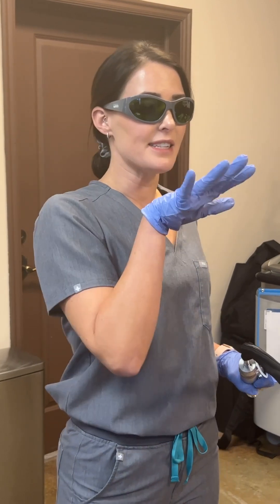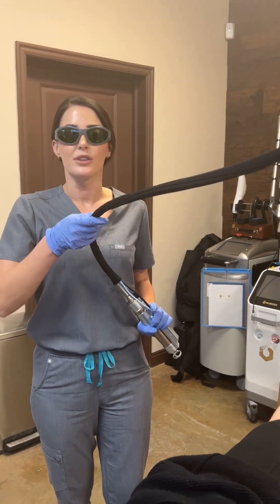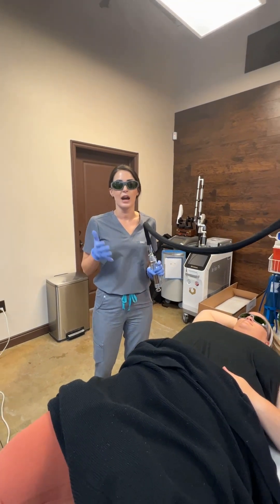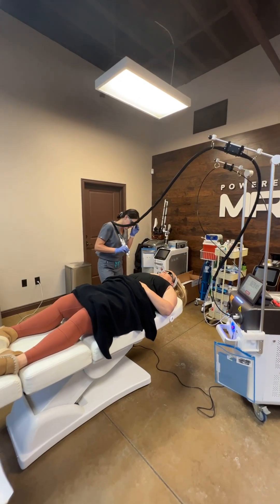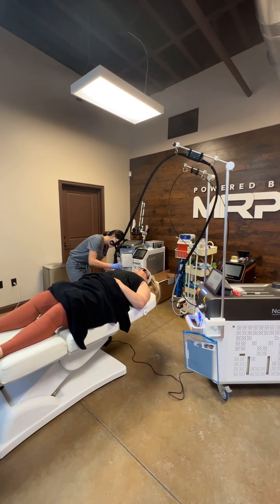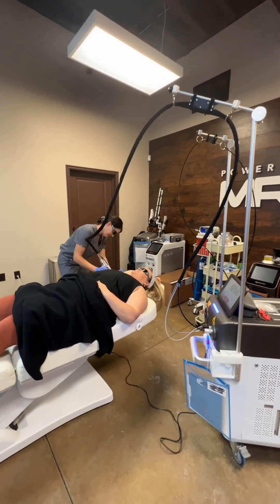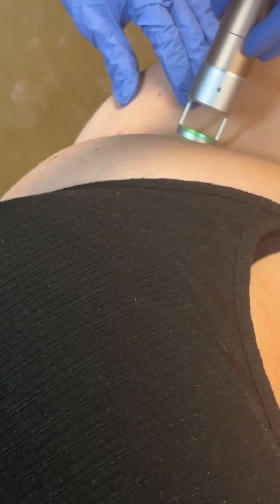That doesn't hurt at all. The device is still in the same area where I treated the left side of the client. Now I'm on the right side — I didn't have to move my device and I have plenty of room to do a treatment. This is really nice, especially if it's a small room and you're able to get around the patient without having to move the device.